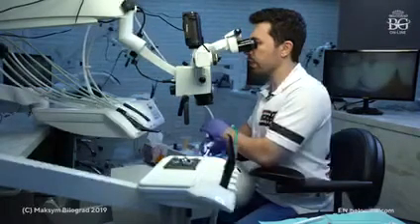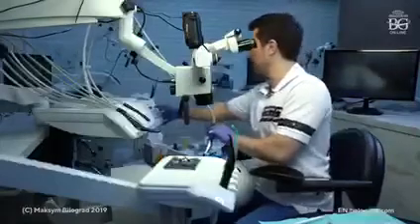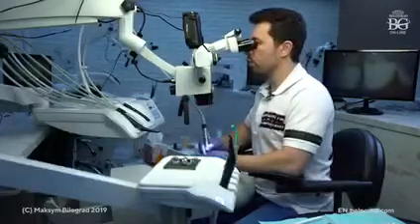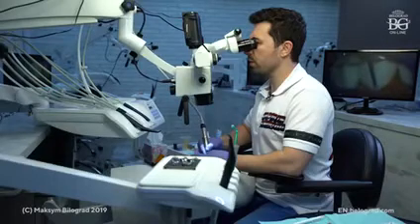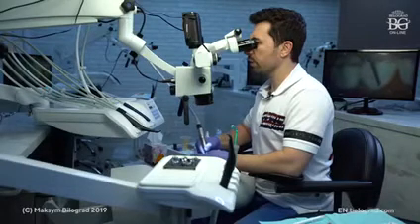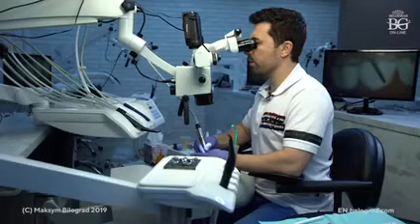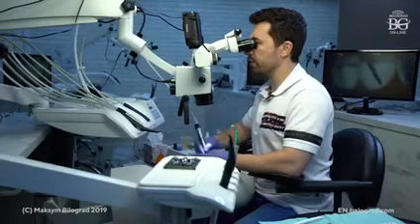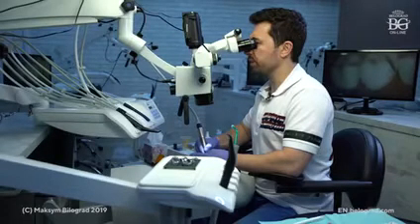Let me take some more water. Okay, that's fine. So we'll do the same from cervical and meso. Turn, don't forget to turn, not this way, to get your finish line done.